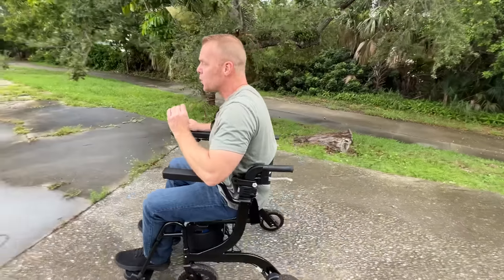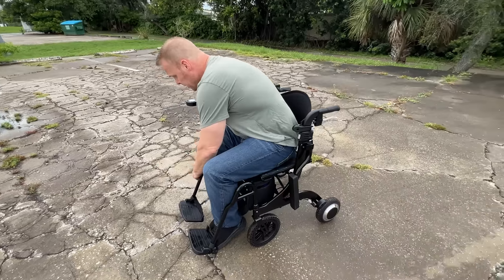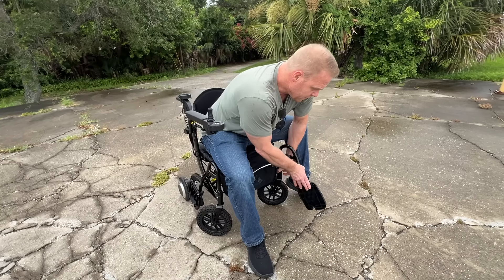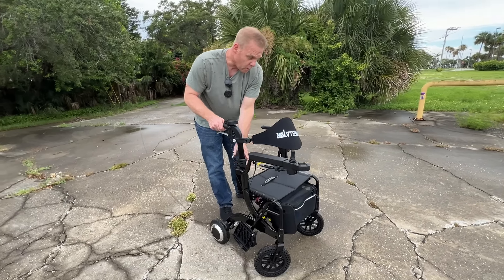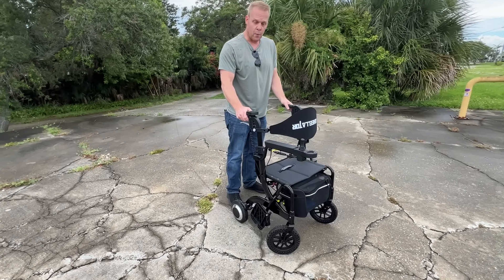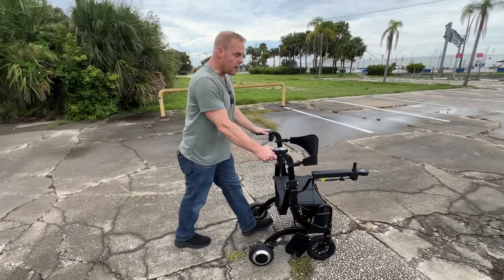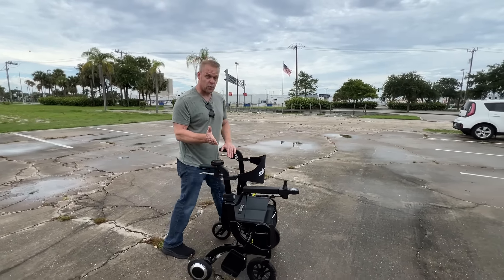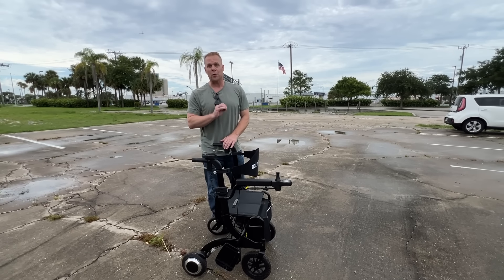What a wonderful device this is. What a great blessing it is to have the ability to become mobile. And if I don't feel like using this as a wheelchair anymore, by pressing a couple of buttons — still sitting down even — I can turn this right back into a walker, the power walker, the Wheelader. I'll go ahead and finish the rest of my journey using this power walker. I really hope that just with this brief video on a warm rainy afternoon, you're able to see how the Wheelader can really get you mobile and enhance your life in a lot of different ways. Thank you so much for watching.